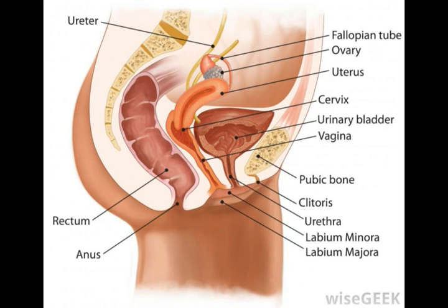Insertion of a rectal tube must be done by a trained professional and it should be completed very carefully using a well-lubricated tube. Patients should be taken to a private area and relaxed for maximum benefits. The nurse or doctor will raise one cheek of the buttocks and carefully insert the tube into the colon. After a few moments, flatus may have exited through the tube, but if not, the procedure may have to be repeated at a later time.